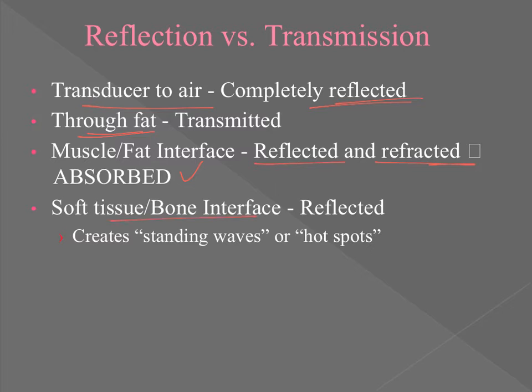And then soft tissue bone interfaces, most of it's going to be reflected and cause those hot spots like I said. So the ideal would be, once we've reduced acoustic impedance, trying to get to that muscle fat interface so that we can have our energy absorbed by that target treatment.